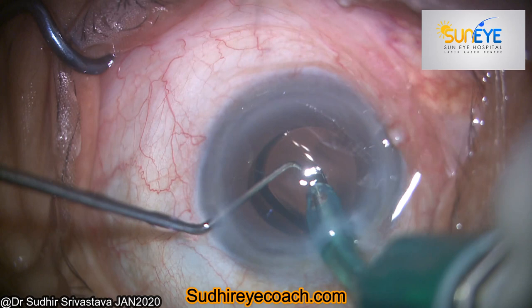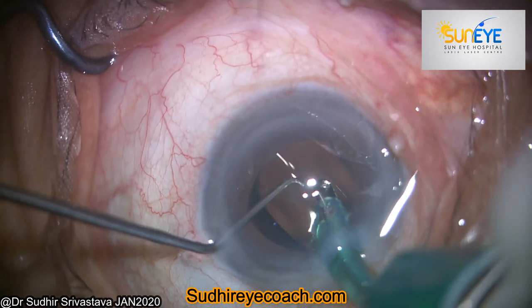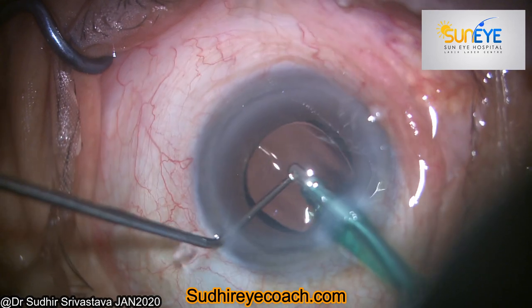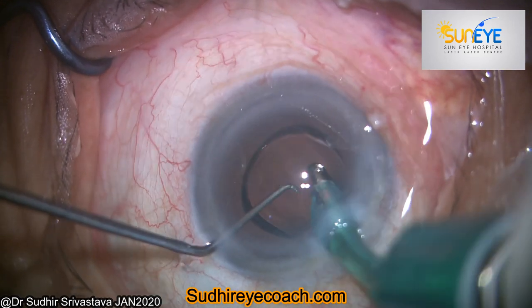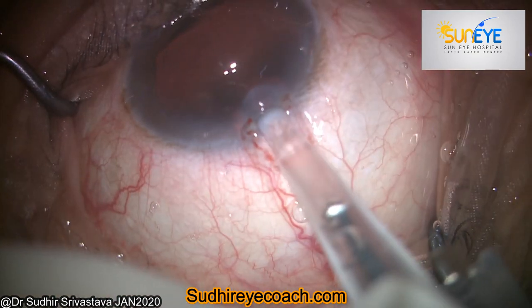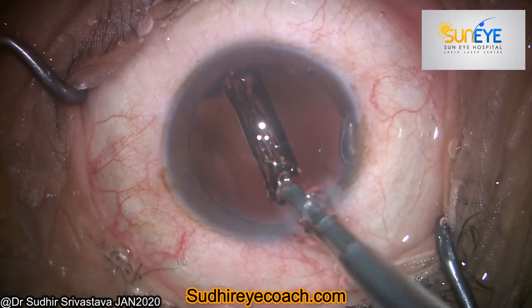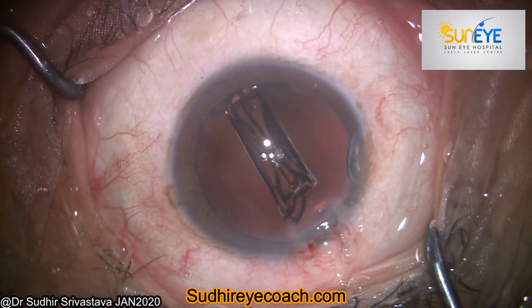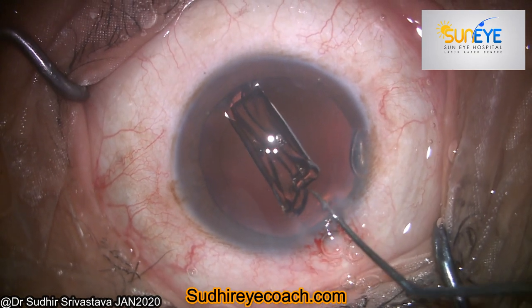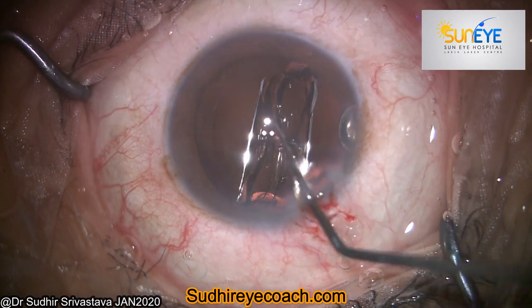Cohesive OVD is best during IOL implantation because its removal is easy and it comes out as a bolus. In comparison to hydrophilic implants, hydrophobic implants are thicker, made of more robust material, and they open gradually in the anterior chamber or in the bag.